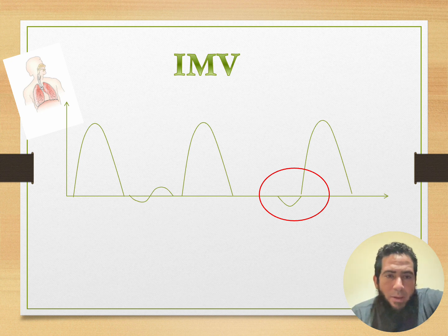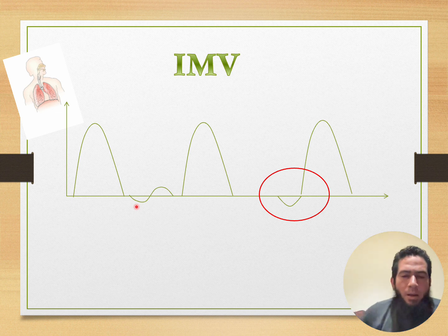So if the patient is taking a breath in the interval, that's okay. If he's taking inspiration and expiration before the next breath, that's fine.